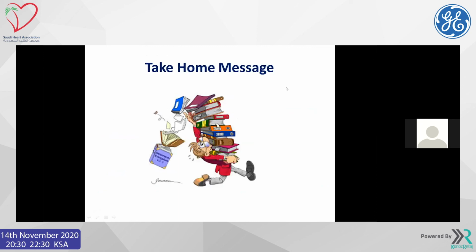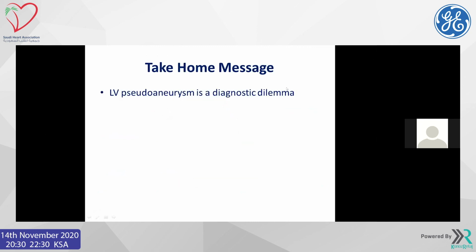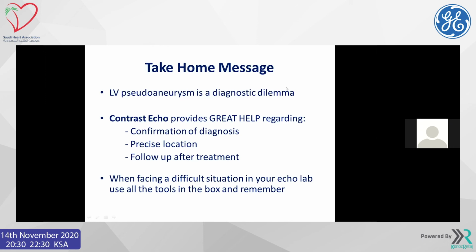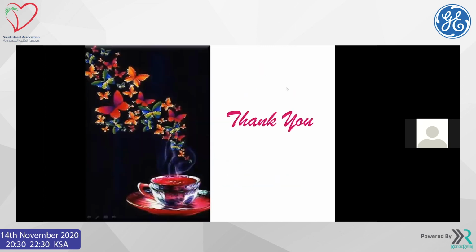Okay, so take-home messages. LV pseudoaneurysm is a diagnostic dilemma. Contrast echo, despite being an off-label use, provides great help regarding the confirmation of the diagnosis, precise location, and follow-up after the treatment. When facing a difficult situation in your echo lab, use all the tools in the box and always remember contrast. Thank you.